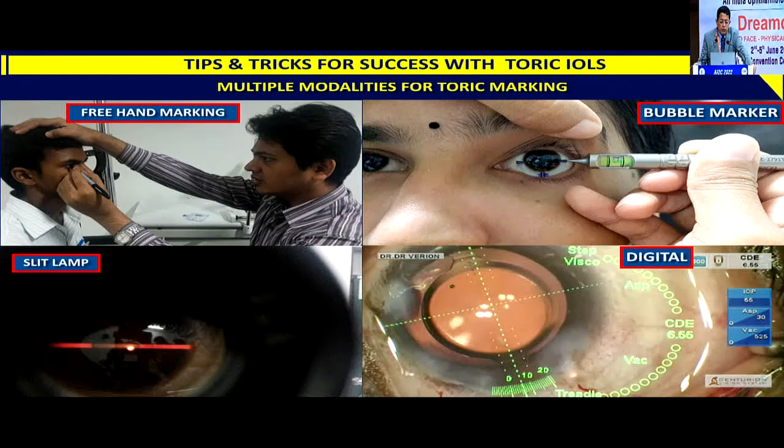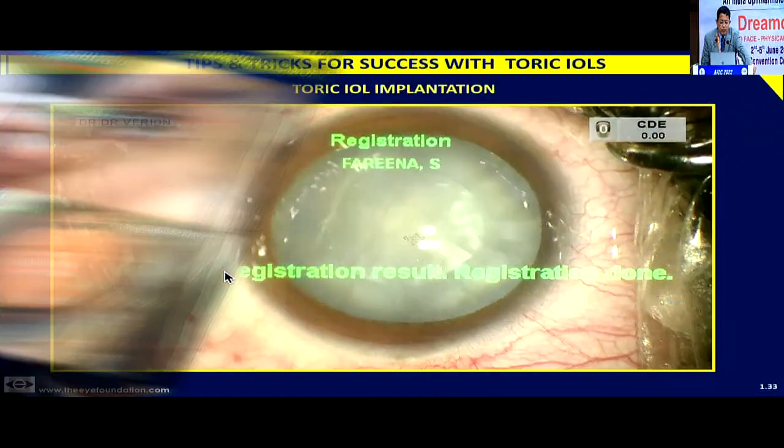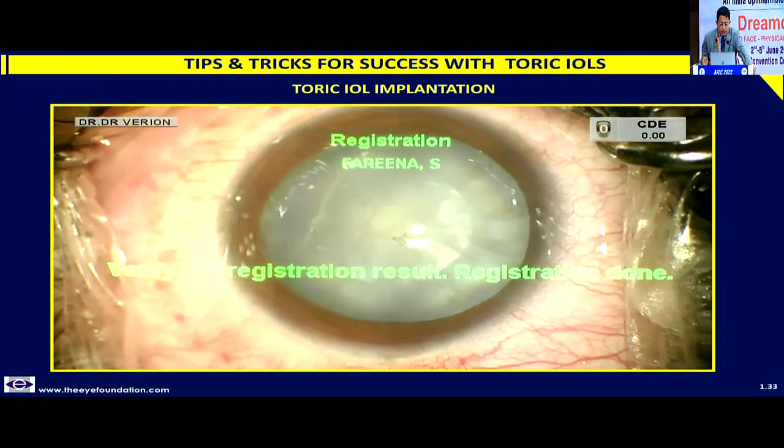I'm not going to go into the details of marking, but stick to one, adopt one. In case you can afford a digital marking device, it's again a good investment. But then once you have mastered a particular technique, I have done live surgery in different centers, and I find that each center has its own marking device and the surgeon swears by that. So do not experiment with too many. Go ahead and have a look at them. Whatever works for you, go ahead and use it, and you will find that it functions quite well.